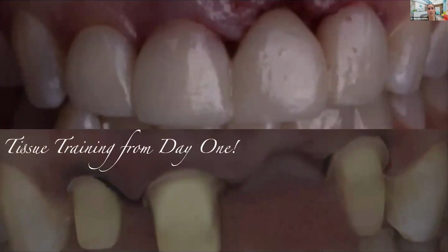It's a printed bridge. But the other thing that I love about this stuff is I can start tissue training from the very beginning, and I can adapt that, right? Because I can take that off as she's healing and I can modify, add flowable, I can change things. So I can really create that ovate pontic site that I want when it comes time to do her finals, right? And so that's super helpful that I'm not losing that papilla there, that I'm able to really help shape that tissue the way that I want to.